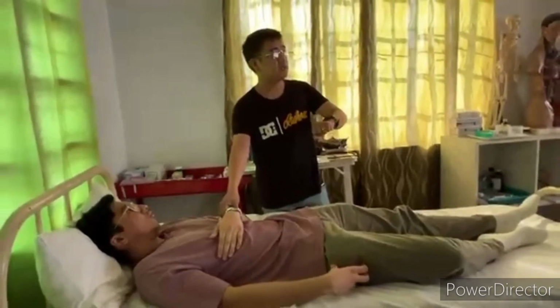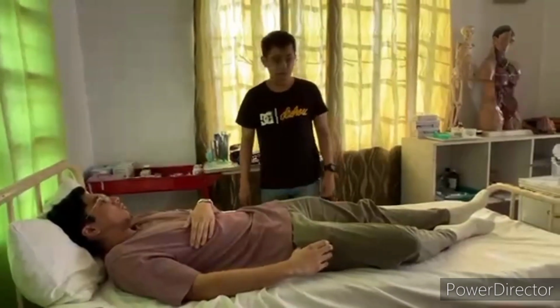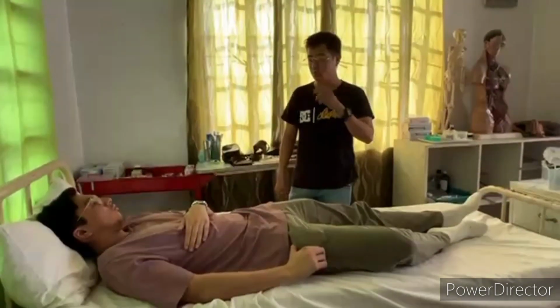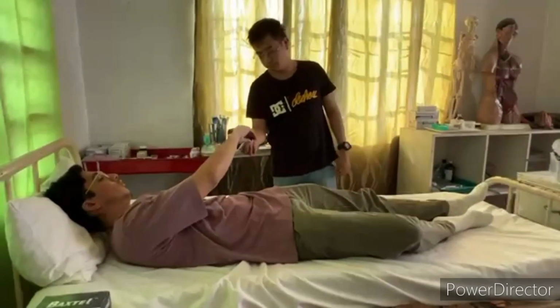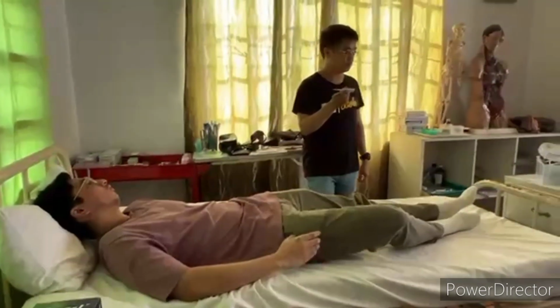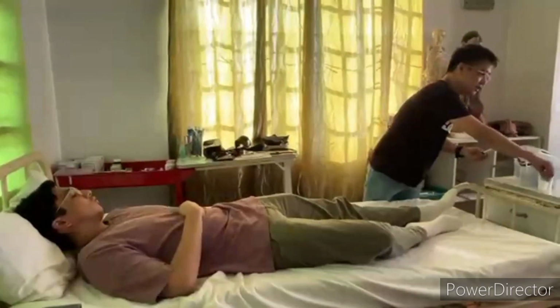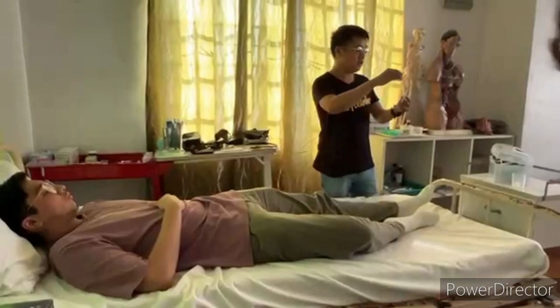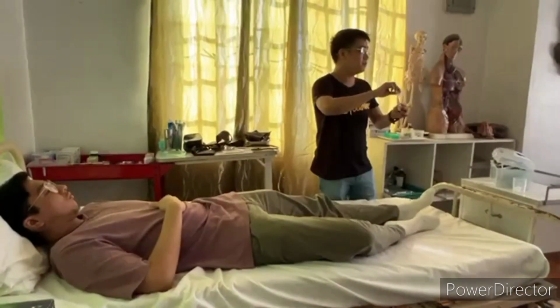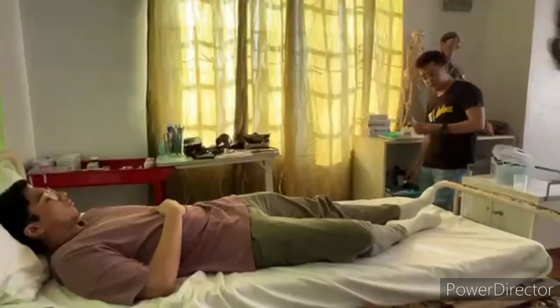Okay, so after counting the number of cycles per minute, you may now ask the patient to give you the thermometer. Sir, can I have the thermometer? Okay, check the result. And then, before putting it back to the receptacle, you have to clean it first using the cotton ball soap and alcohol. Do the same thing, clean from the tip to the handle and then discard to the trash bin nearby.